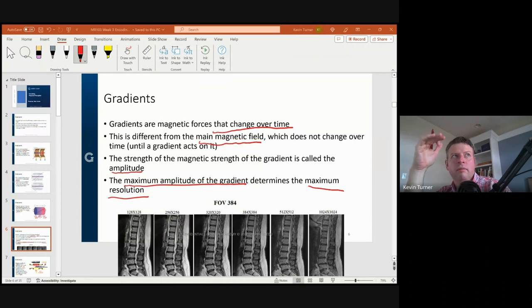So when they hired another company, they said, we have too many MRIs. We can't keep doing them inside of our room because we've got so many patients to schedule. So they hire another company who brings out a trailer with an MRI, and they put the trailer in the parking lot of the hospital. So now they have an extra MRI. They just have the patients go out through the parking lot, go to the trailer, and get scanned on the trailer, right? Some techs hate scanning on a trailer.